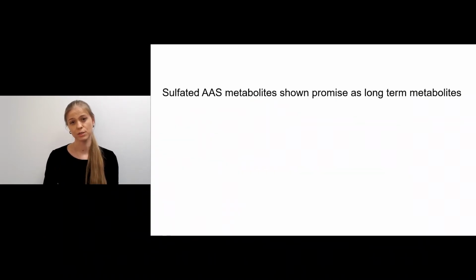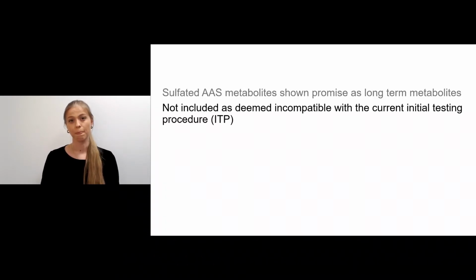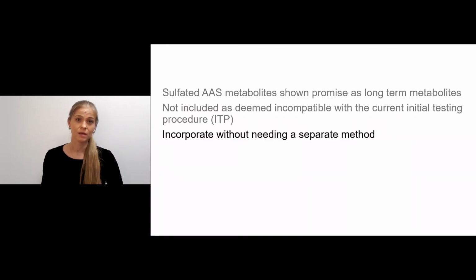Now, as such, evidence has shown for the past 10 years that an extended detection time can actually be provided by the sulfated metabolites. However, they are deemed incompatible with the current setup. So ideally, one would want to include them without needing to analyze them in a separate method, as that is not economically feasible for the anti-doping laboratories.